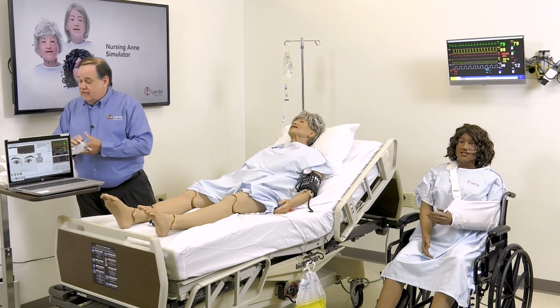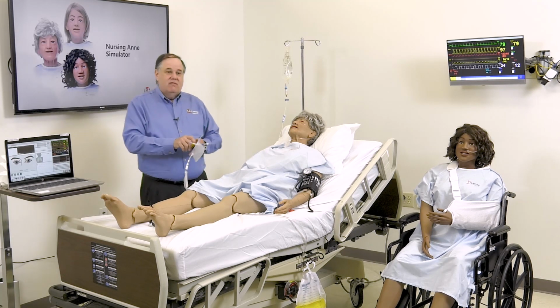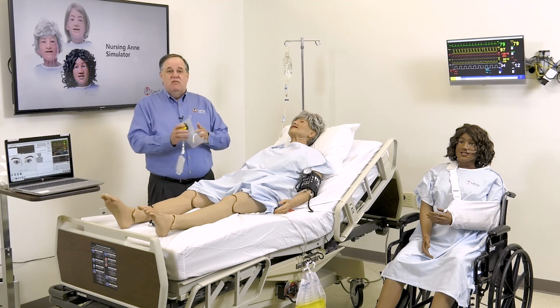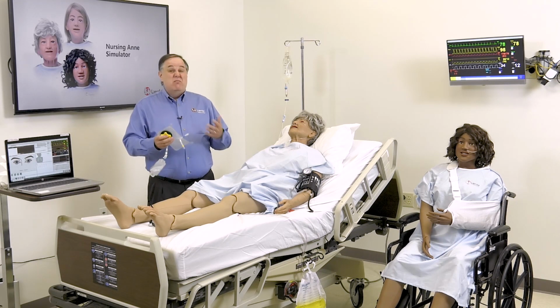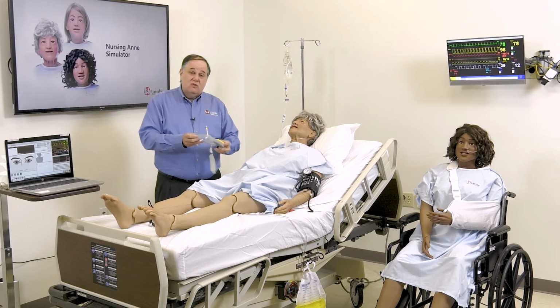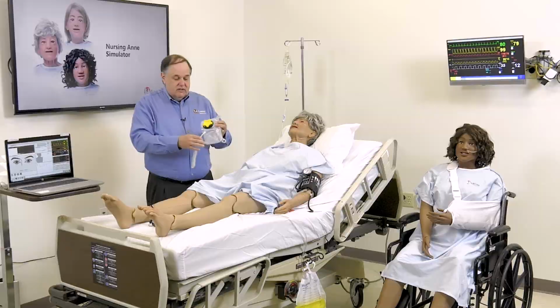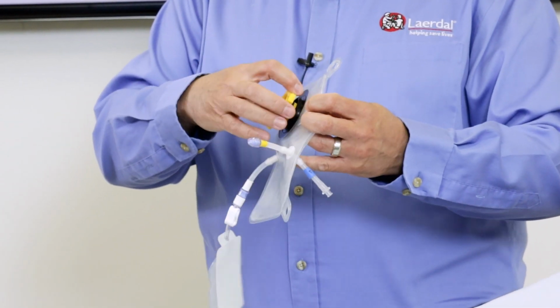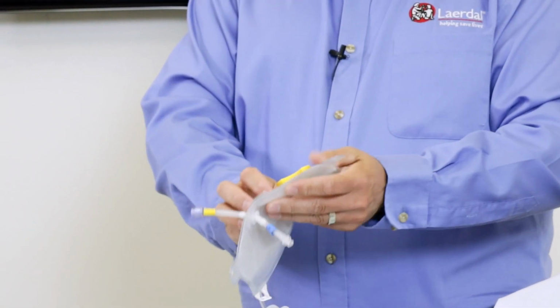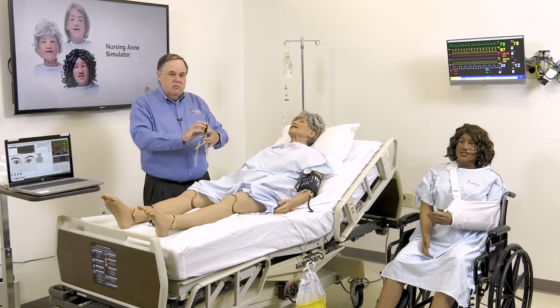The fluid bags, can they be removed for cleaning and disinfection? Yes, they can. This is the actual fluid bag, and that's a great question, and thank you for asking, because I know some of our concern is how easy it is to remove it, clean it, and prevent any molding and make sure that you're protecting the longevity of your mannequin. Absolutely, each reservoir bag is identical with just different ports and color coded. They're absolutely the same. They're easily removed. They attach inside by these two tabs and can be easily removed.